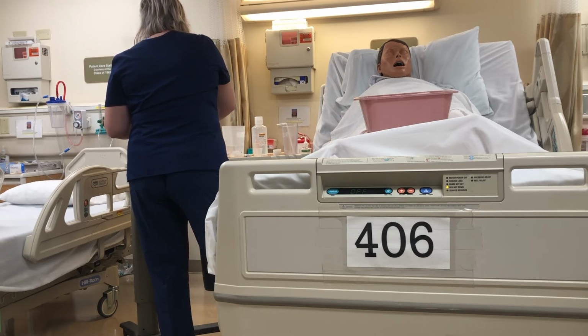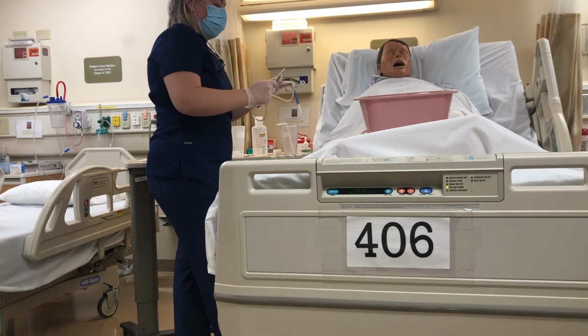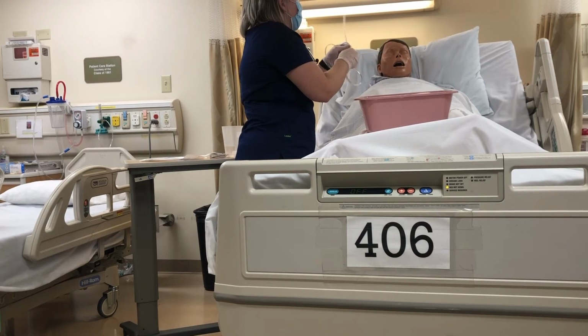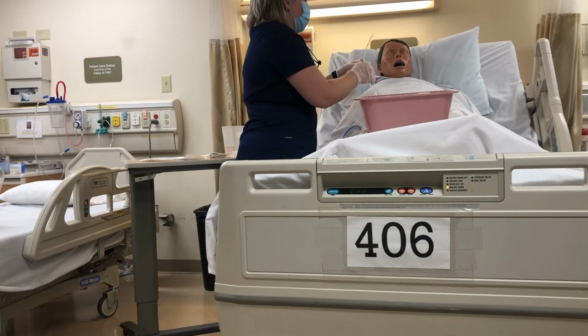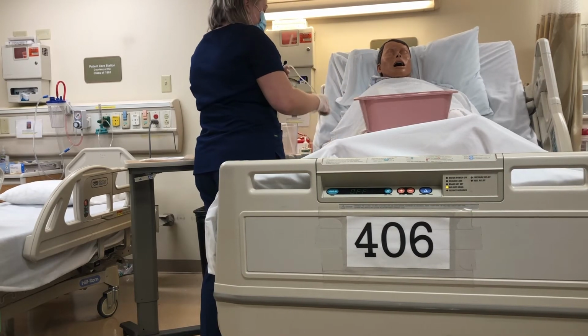Okay. So the first thing I'm going to do is measure the tube. I want to make sure that I'm placing it at an appropriate length. So I'm going to measure from the tip of your nose to your ear, and then from the tip of your ear down to your xiphoid process. So that's looking about 54, and then I'm going to add 10.